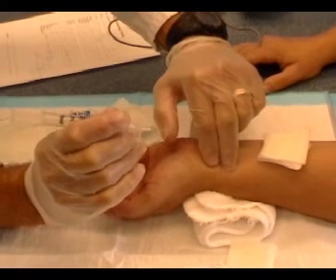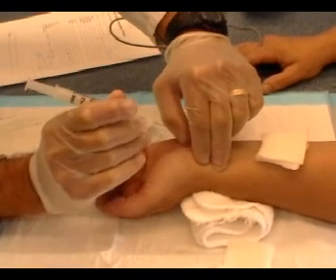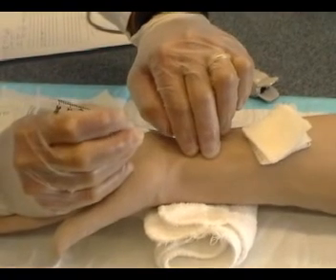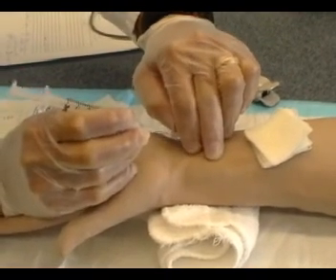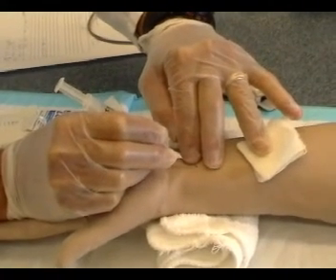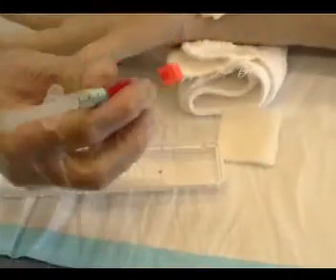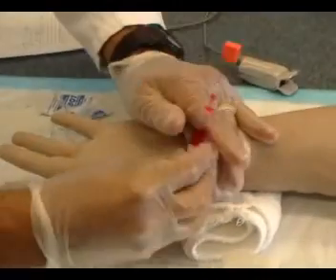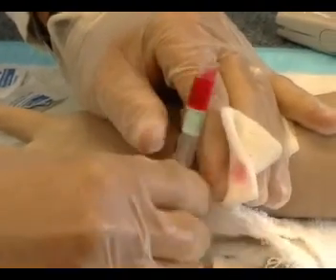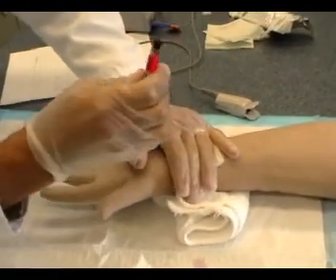I'm just going to palpate your wrist here — you can just feel your pulse. Now you're just going to feel that little pin prick there for a second. I'm ready. You're just going to feel that little poke now. Woo! I don't like needles. Just — okay. You okay? Not bad. Just going to hold a little pressure on there. I'm just going to take out that little bit of air in the sample. Excellent. You okay? How's that feel? It's a little sore. We got your sample right away. Good job.